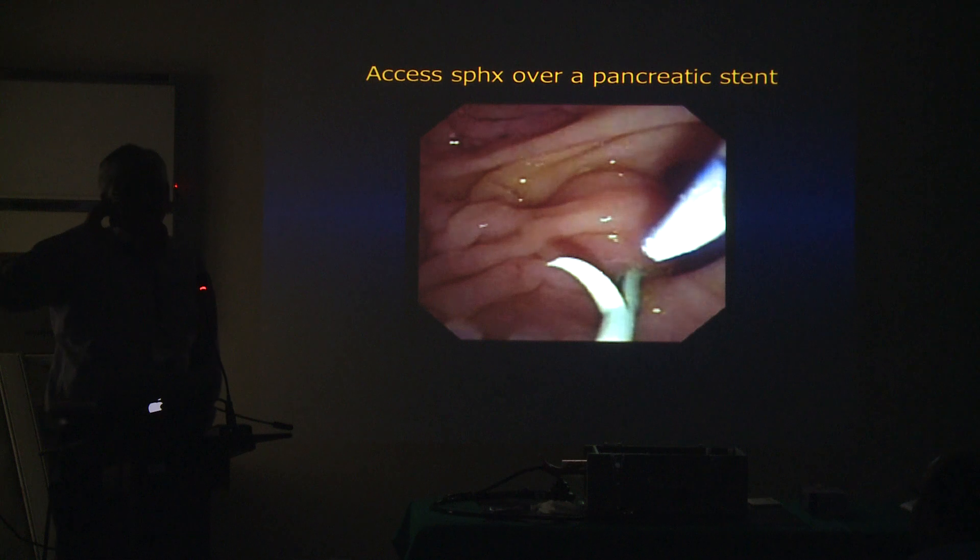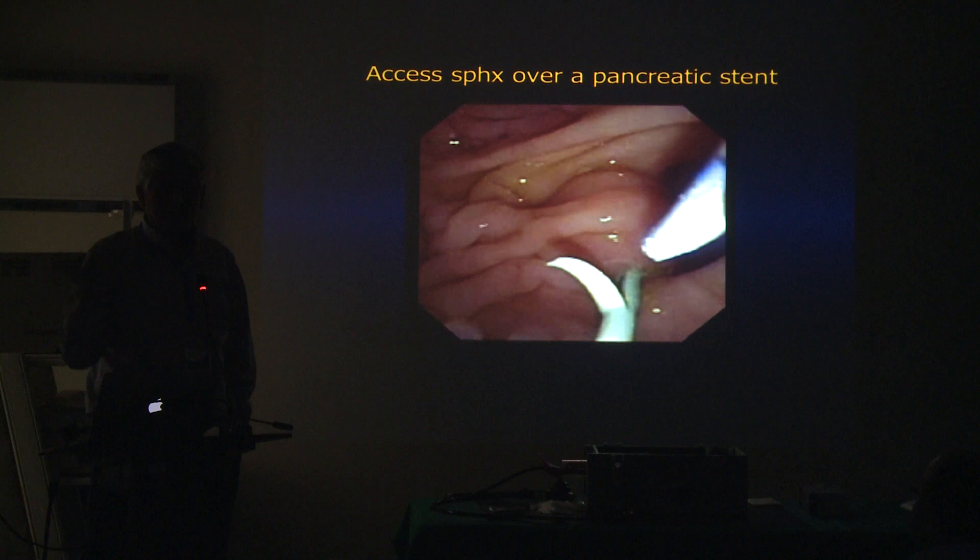We're going to ask Khalid to do a standard ERCP, so you have an idea before the candidates go in of how easy or difficult ERCP is when doing it by ourselves. When we're trying to do it and let you play with the ampulla, it obviously makes it difficult for us as well. But that's why we're here. We'll see this one case, and then one after another you'll each have a go.